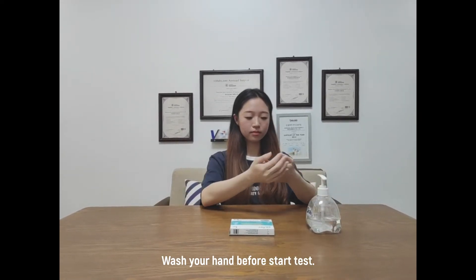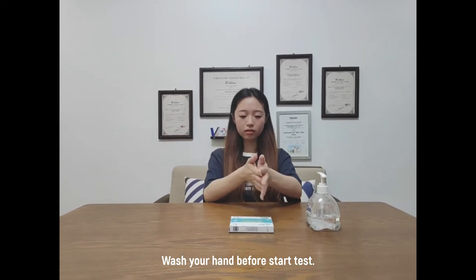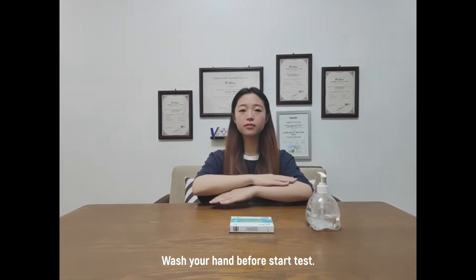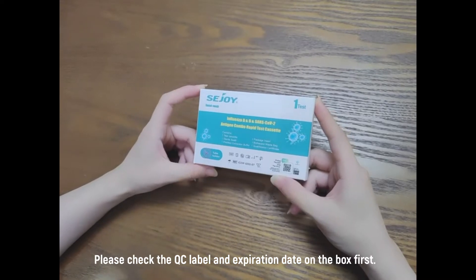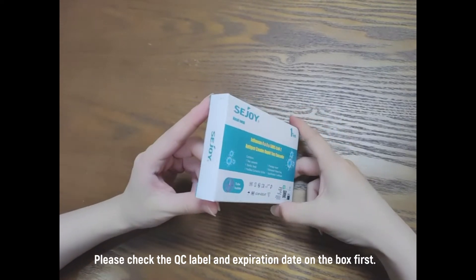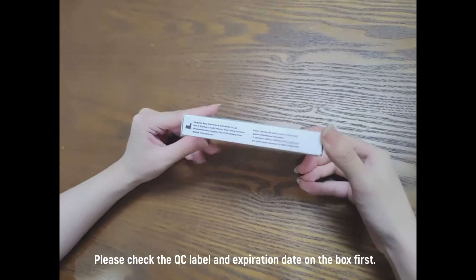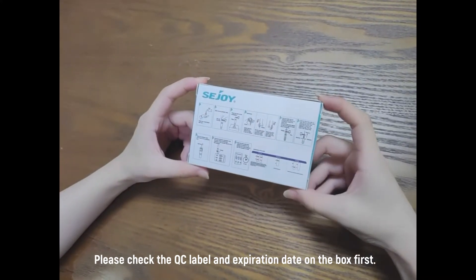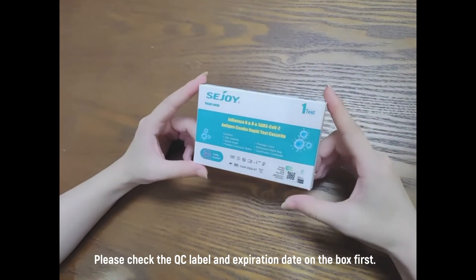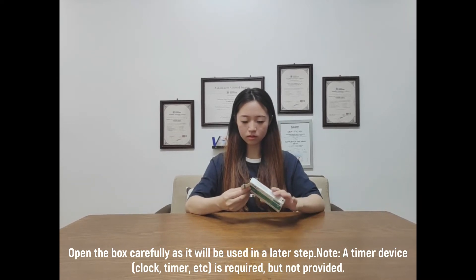Wash your hands before starting the test. Please check the QC label and expiration date on the box first. Open the box carefully, as it will be used in a later step.